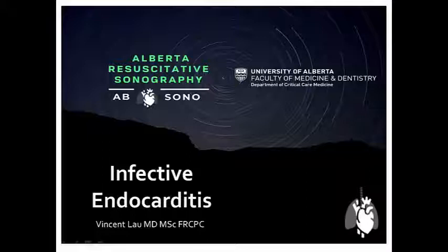Hello again, everyone. Vince Lau here with another POCUS TEE series case. Today we'll be going over the interrogation of valves to assess for endocarditis using TEE.